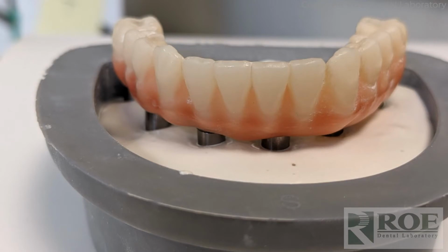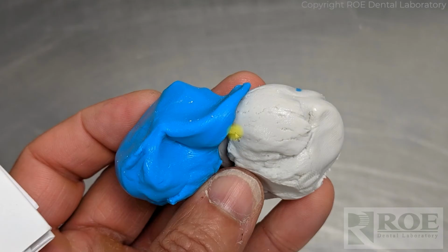And once it's set, see here, there's even a little bit of space below it. You want the analogs to be just above the stone. Don't let it get down in to the stone. We don't need the intaglio of the prosthetic. All we need is the analogs captured. And we don't want to lock the prosthetic down in the stone. So a little bit above the stone is fine.